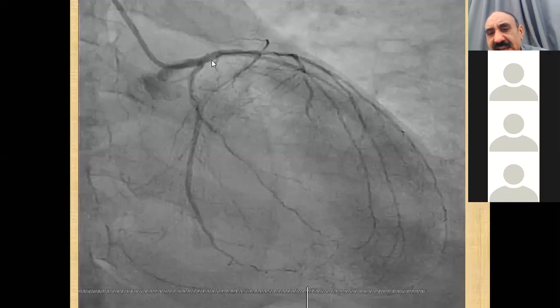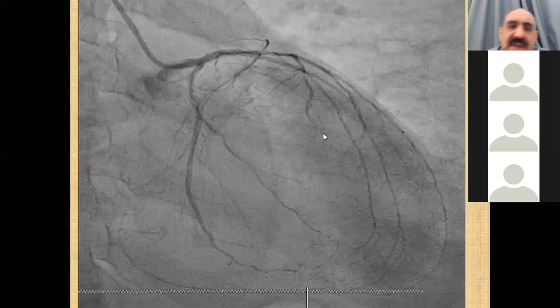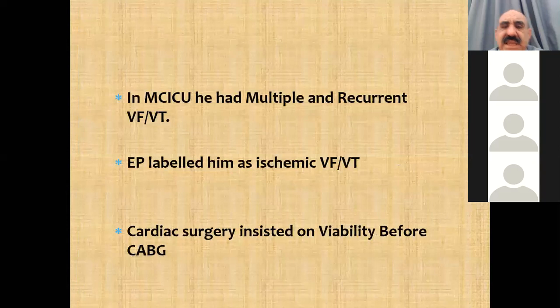He had a cath, and you can see that in his cath, first the RCA is occluded. We can see the RCA from the left injection. The circumflex and the LAD are diffusely diseased. The catheter lumen is only 2 millimeters in diameter, and you can see that all the vessel calibers are less than 2 millimeters. So the patient has severe diffuse 3-vessel disease.